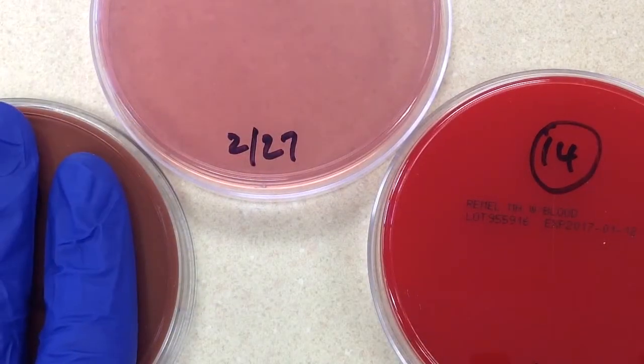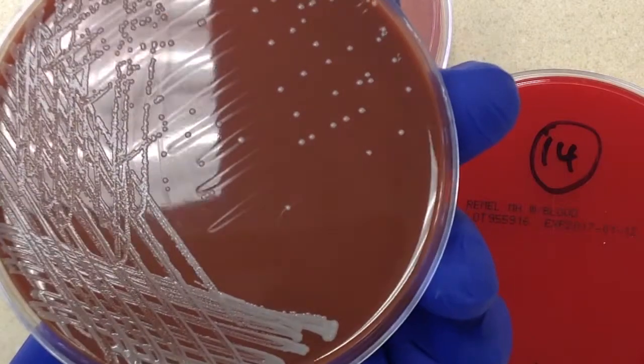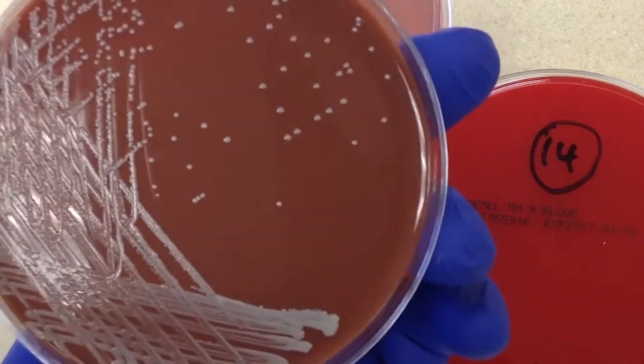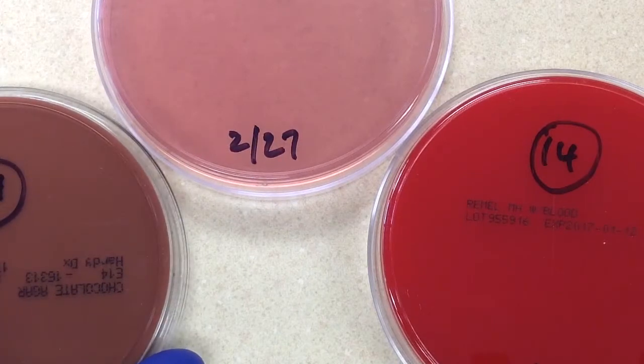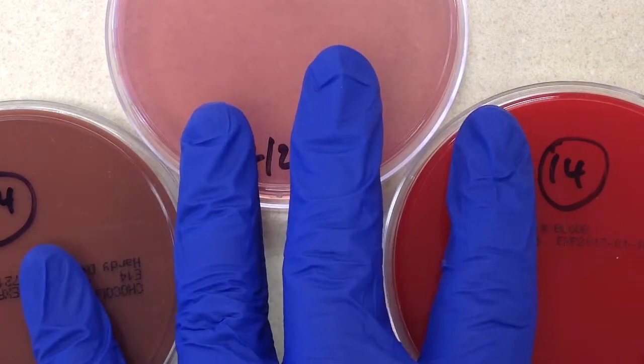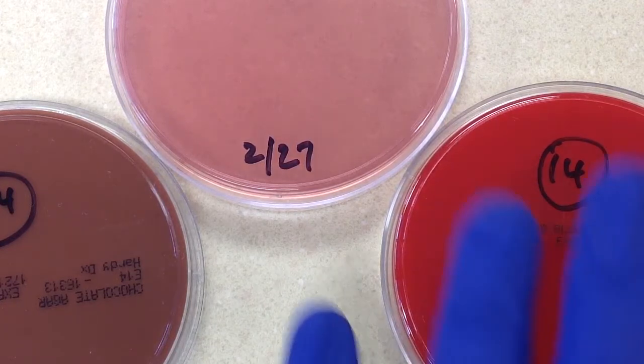Assuming this is catalase-positive, in my experience it looks like coagulase-negative staph, which may be Staphylococcus epidermidis — which, of course, is a skin flora and a common contaminant. We've done the catalase and it is catalase-positive. We're going to work this up and send out a preliminary report to the physician. Even though this is probably a contaminant, when we're dealing with sterile body fluids — spinal fluids, things from the OR, blood cultures — we don't make the call whether it's significant or not. We let the physician make that call and report out what we have in front of us.